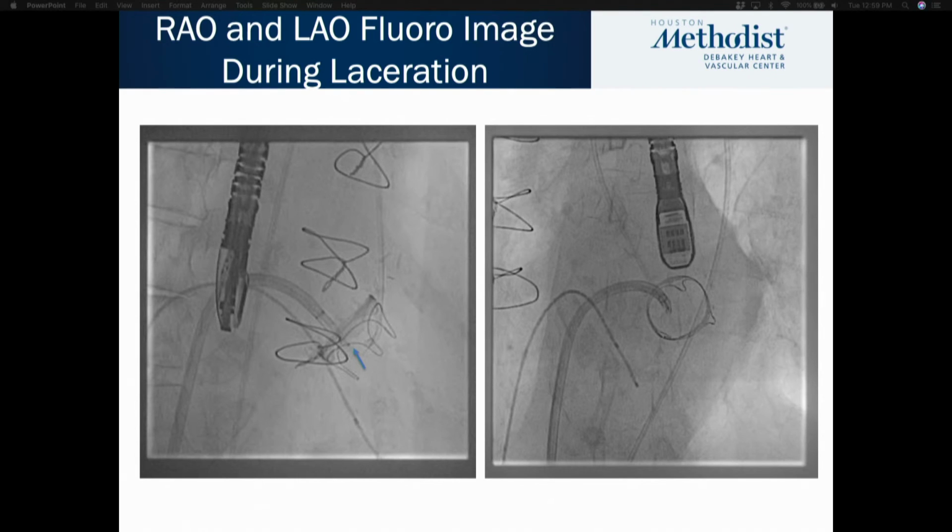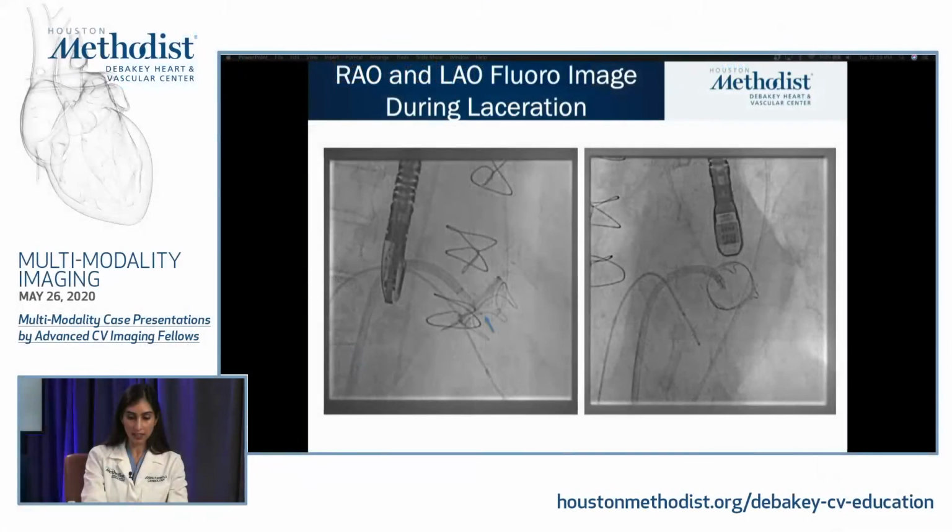After that, you have a Astato wire, which is focally denuded and kinked mid-shaft to form a flying V. I've tried to point out the flying V while it is inside with the blue arrow. So this flying V is formed externally, and then the wire is brought up through the steerable catheter and positioned at the offending bioprosthetic valve leaflet tip using TEE and fluoroscopy.